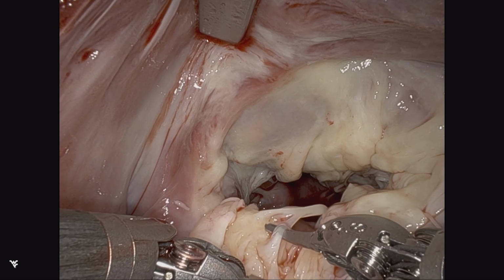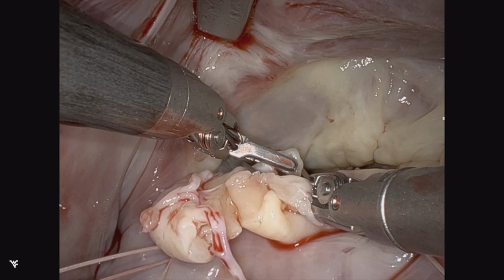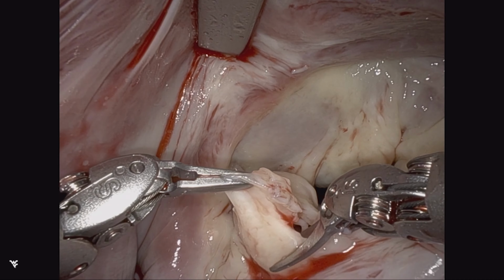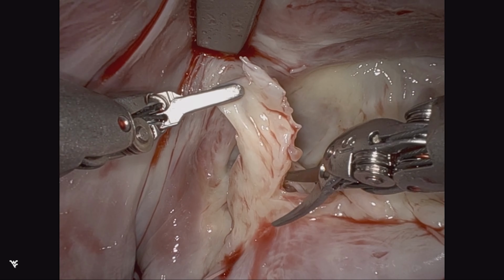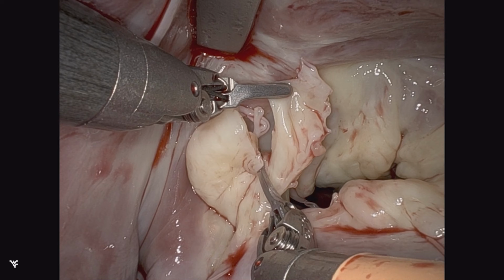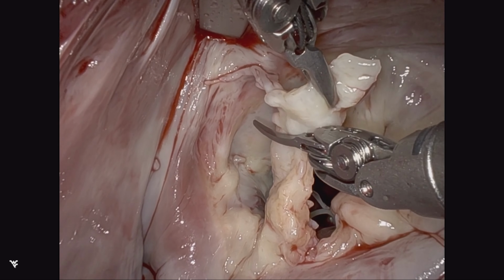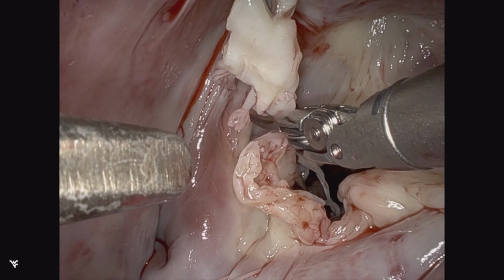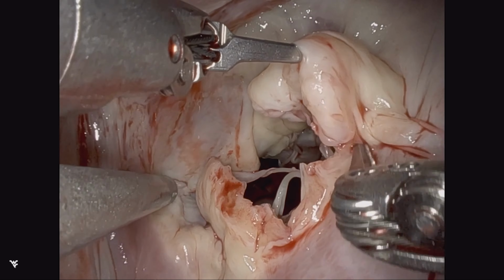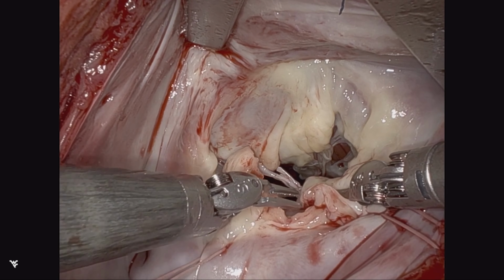But we can see some fairly robust secondary and perhaps even tertiary fan cords that I've decided to divide for later, and then undermining this tissue until we have good supported leaflet. As you can see, there's a cord group on the P1 side, and then undermining all the way to P3. You can see there's a little MAC, or mitral annular calcification, there at the base of P3, which we're going to avoid.